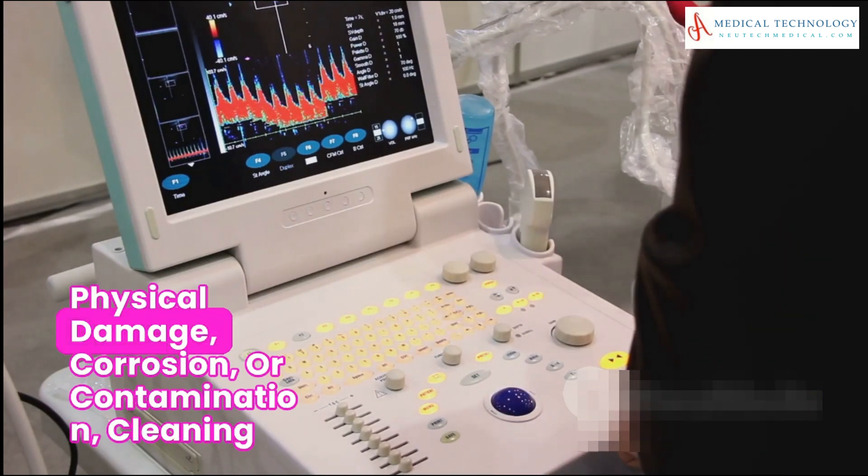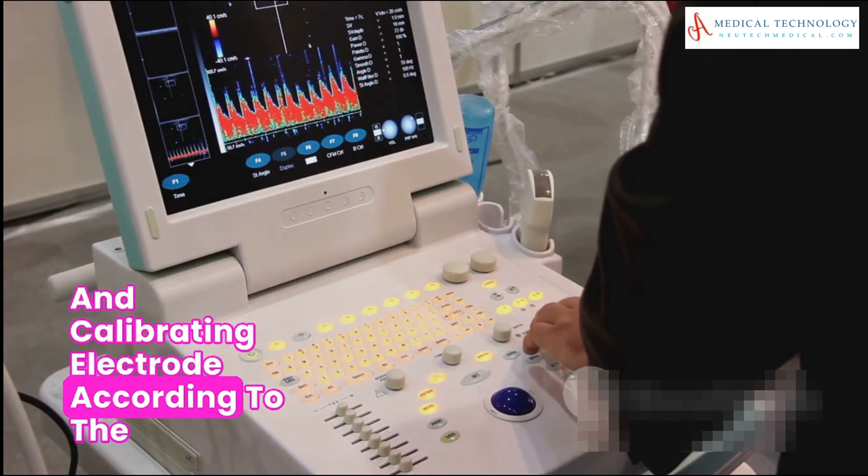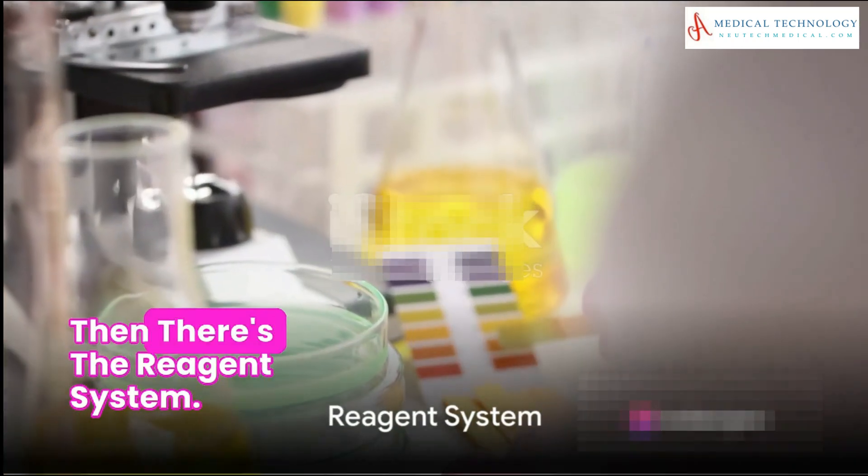Now let's talk about electrode and sensor inspection. You should inspect these for any physical damage, corrosion, or contamination. Cleaning and calibrating electrodes according to the manufacturer's recommendations is also essential.